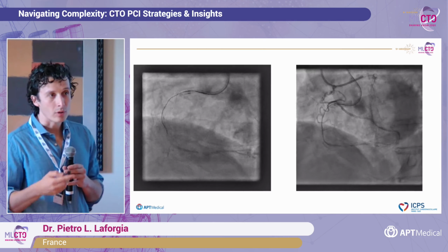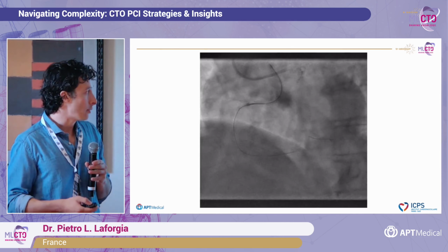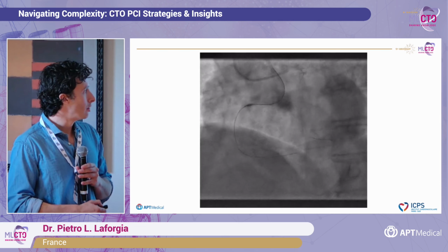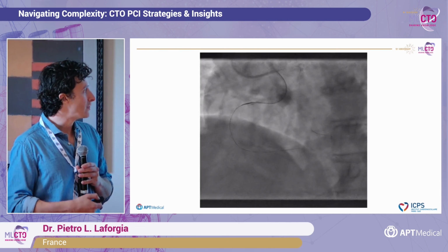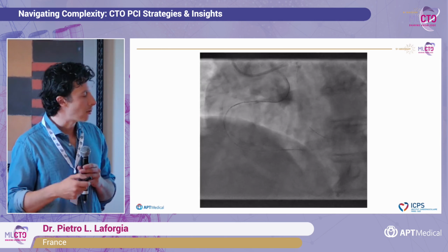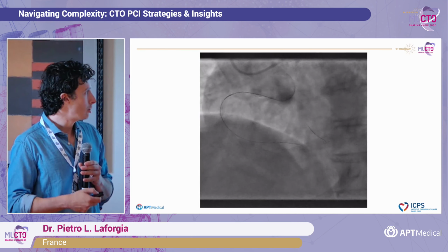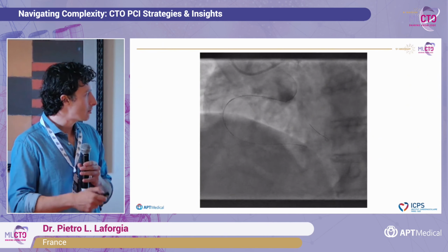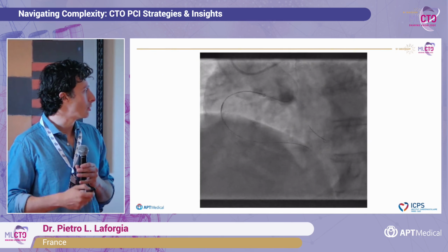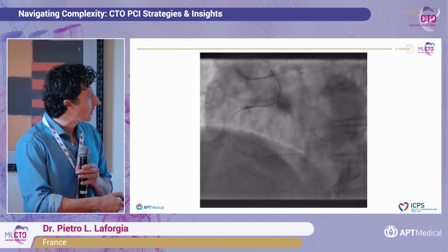Not all the time you are able to advance your microcatheter and do your job, because that's the most important step. But you can see here the Elongator advances relatively easily with anti-clockwise rotation. Don't need to push a lot. You wait and you let it advance a little bit, just doing anti-clockwise rotation. It passed the lesion quite easily, despite being quite calcified.